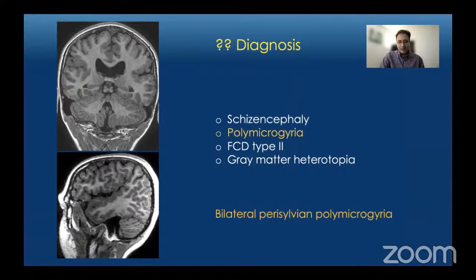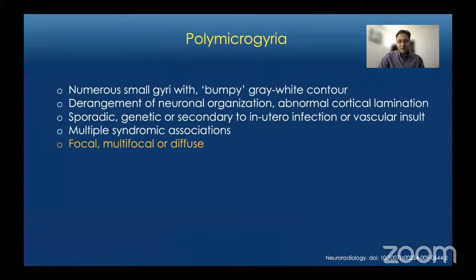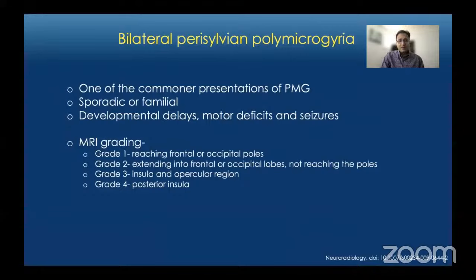Polymicrogyria is characterized by numerous small gyri with a bumpy appearance of the gray-white contour. It is caused by derangement of neuronal organization and abnormal cortical lamination. It can be sporadic, genetic, or associated with in utero infection or vascular insults. Bilateral perisylvian polymicrogyria is one of the common presentations and can be sporadic or familial. There is an MR grading system: Grade 1 is most severe with perisylvian involvement extending to frontal or occipital poles; Grade 2 extends into those lobes but not the poles; Grade 3 is purely insular and opercular; Grade 4 involves only the posterior insula bilaterally.